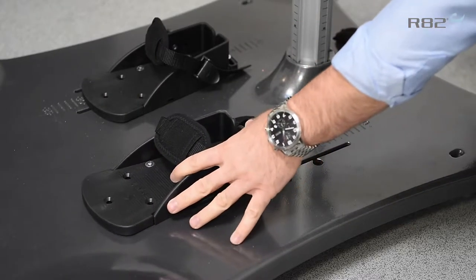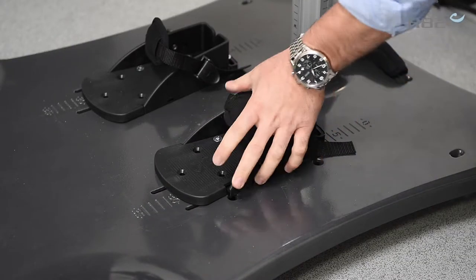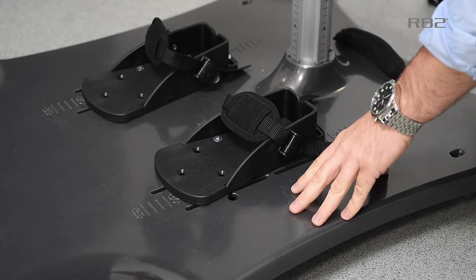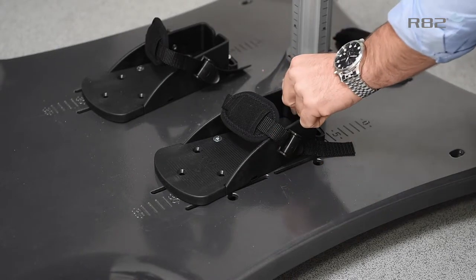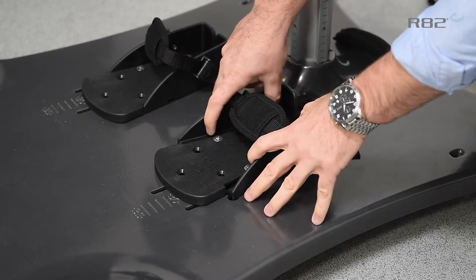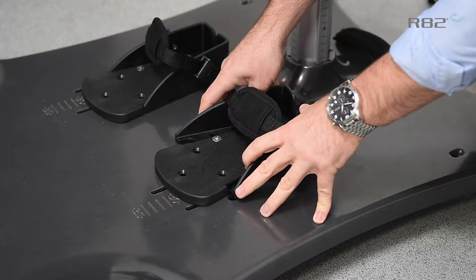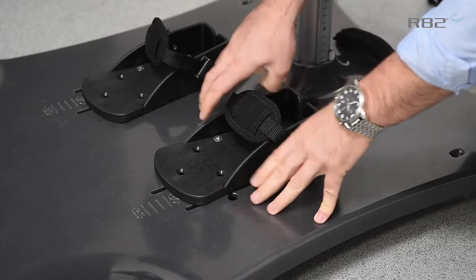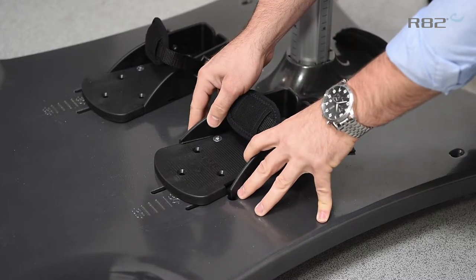Precise foot adjustment is also a crucial part of any standing frame. What we have here with the Meerkat is lots of different possibilities which are easy to adjust and find the right position. We have a simple sandal but with width adjustment built in, so as the child grows and the shoes change you haven't got to change the sandals. There are two allen key adjustments on here and then you can lock off the width that you want.